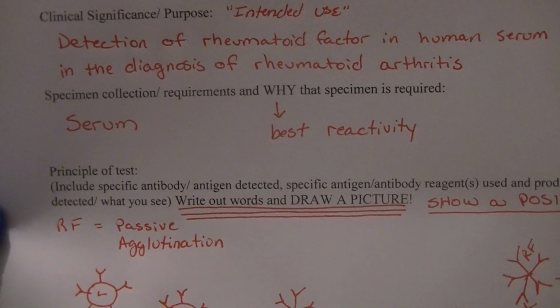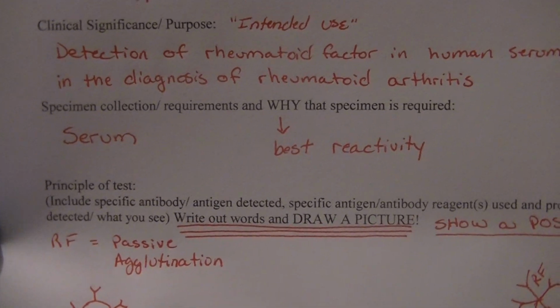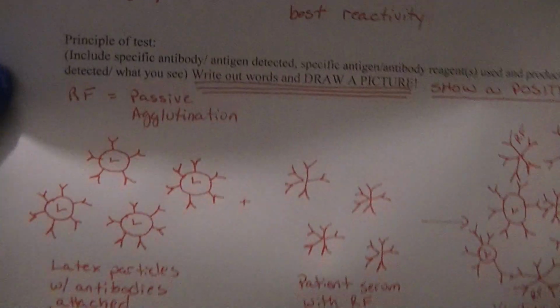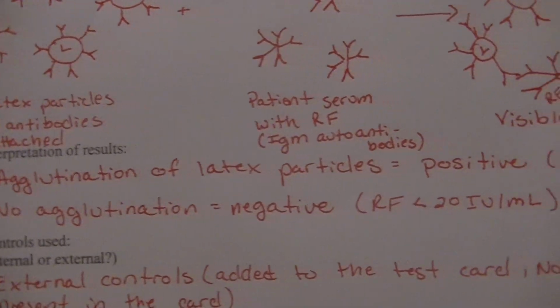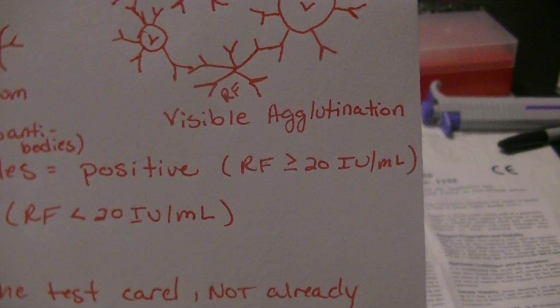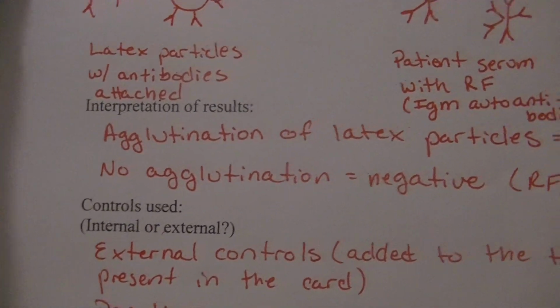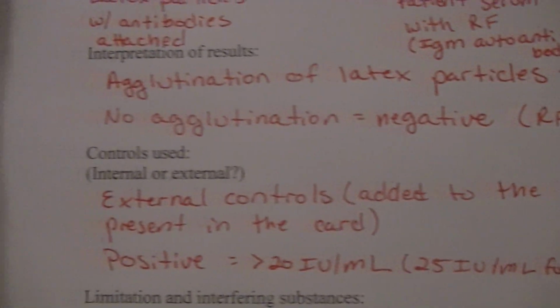It also wants to know what type of specimen requirements there are. We should collect a serum sample for this test. It gives the best reactivity. All right, I'm going to skip down to interpretation of results. Agglutination of latex particles gave us a positive result, and it tells you in the package insert that RF must be greater than 20 IU per ml for that to come up positive. If there's no agglutination, the test is negative, and so the level of rheumatoid factor is less than 20.